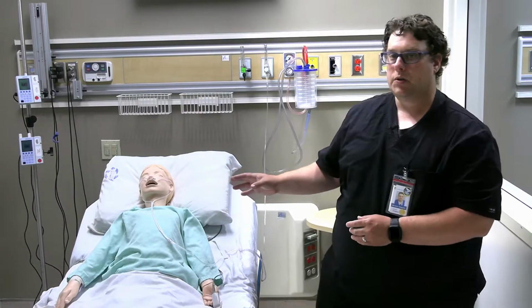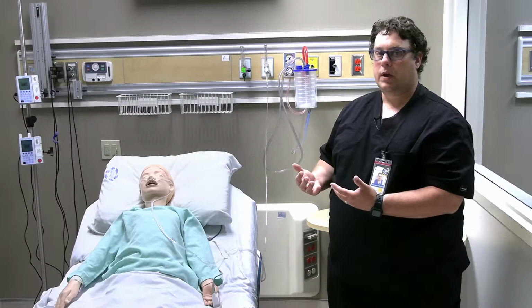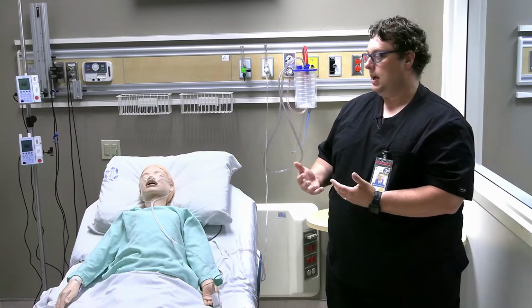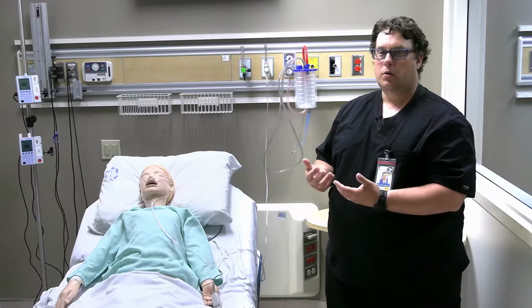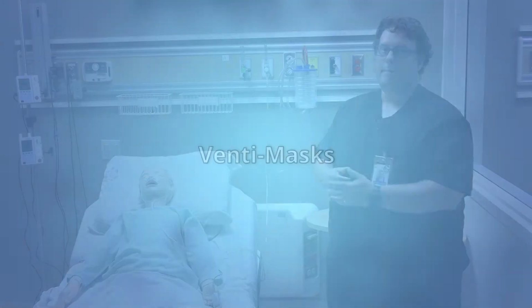So now we're currently on 2 liters per minute, and we would then reassess our patient to see how they respond to the application of oxygen therapy. Again, if this child does not respond immediately, you can increase your flow up to a max of 4 liters per minute and go from there.